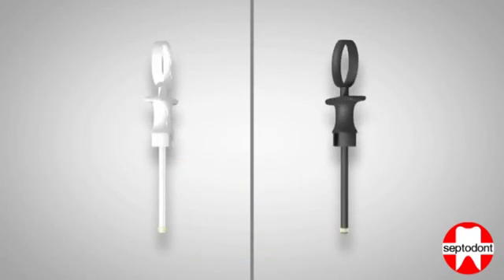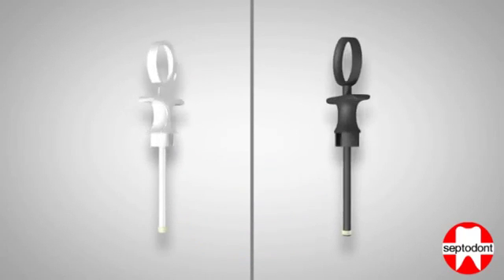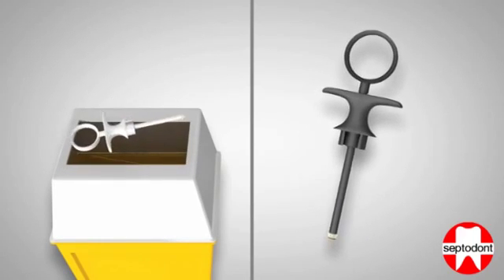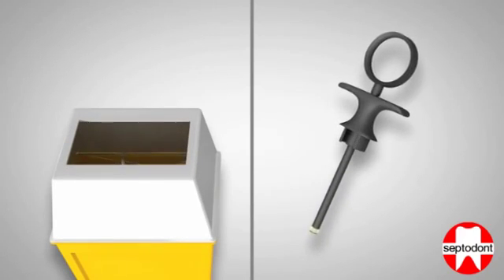If you're using a white single-use handle, it can be disposed of as well. If you are using a black polycarbonate handle, it can now be sterilized.